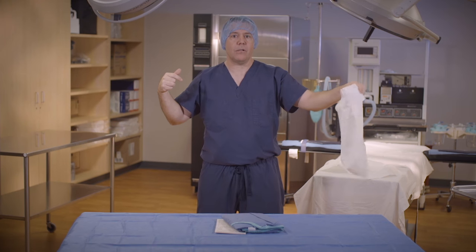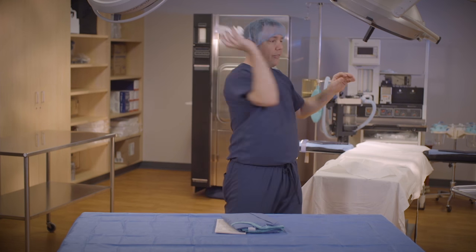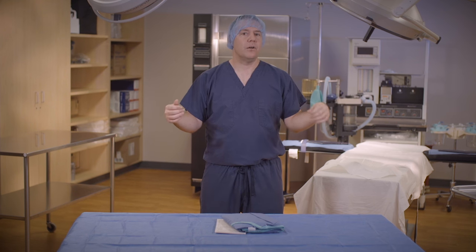Now I'm going to discard the towel in a proper receptacle or give it to a member of the non-sterile surgical team. Do not bunch it up. Do not throw it across the room. Those are all no-no's. Now that we've dried our hands, I'm going to secure the gown by grasping the center of the gown near the neck with one hand and lifting the gown off the sterile field.